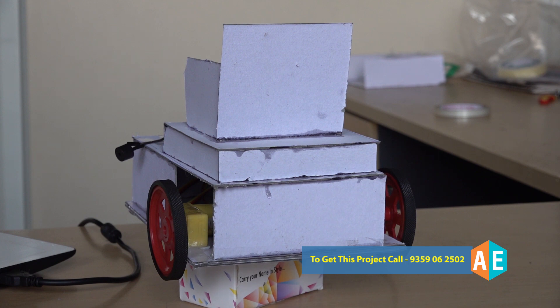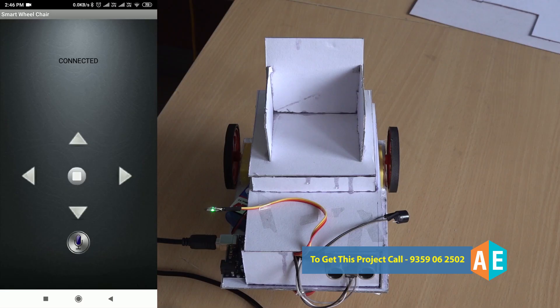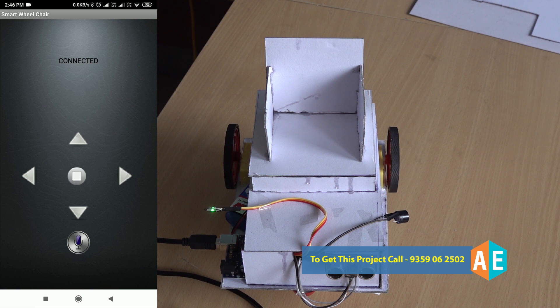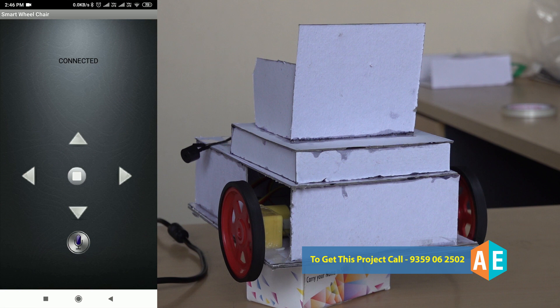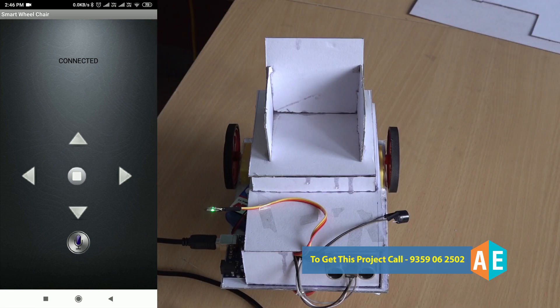One important feature of this wheelchair is that it has obstacle avoidance. Whenever the wheelchair is moving and there is an obstacle in front of it, it will be automatically stopped. For example, now I'm moving the wheelchair in the forward direction — as you can see, it is moving forward — and if there is an obstacle in front of it, it will be stopped.